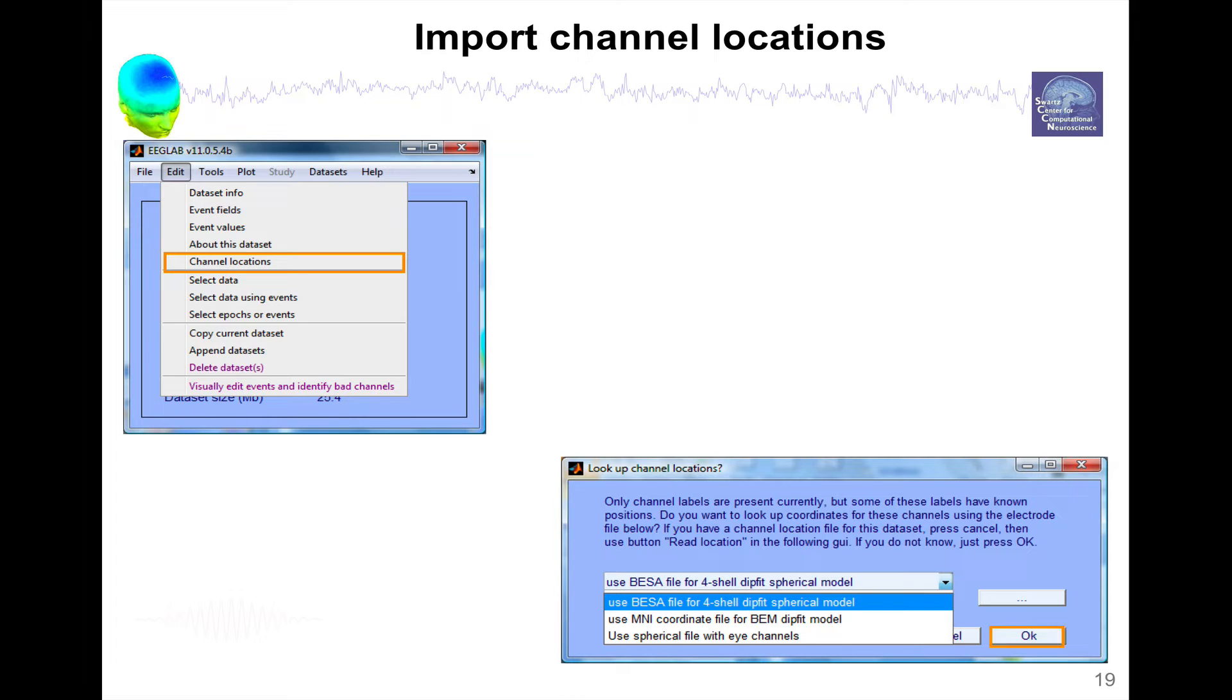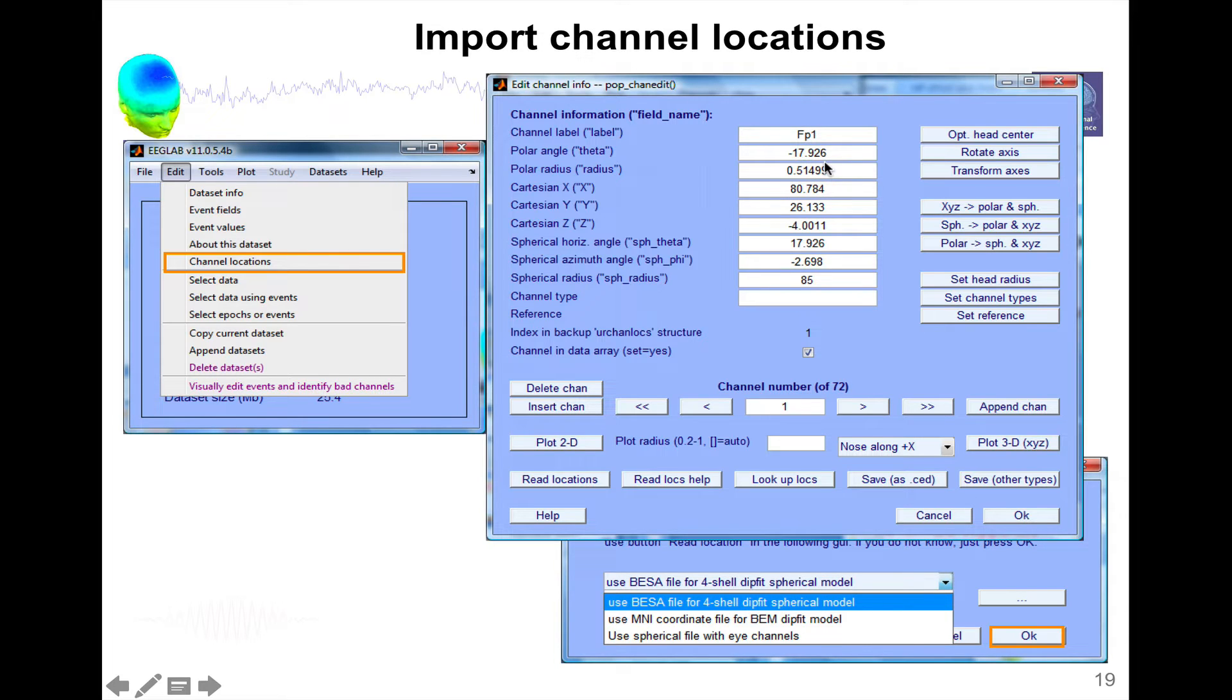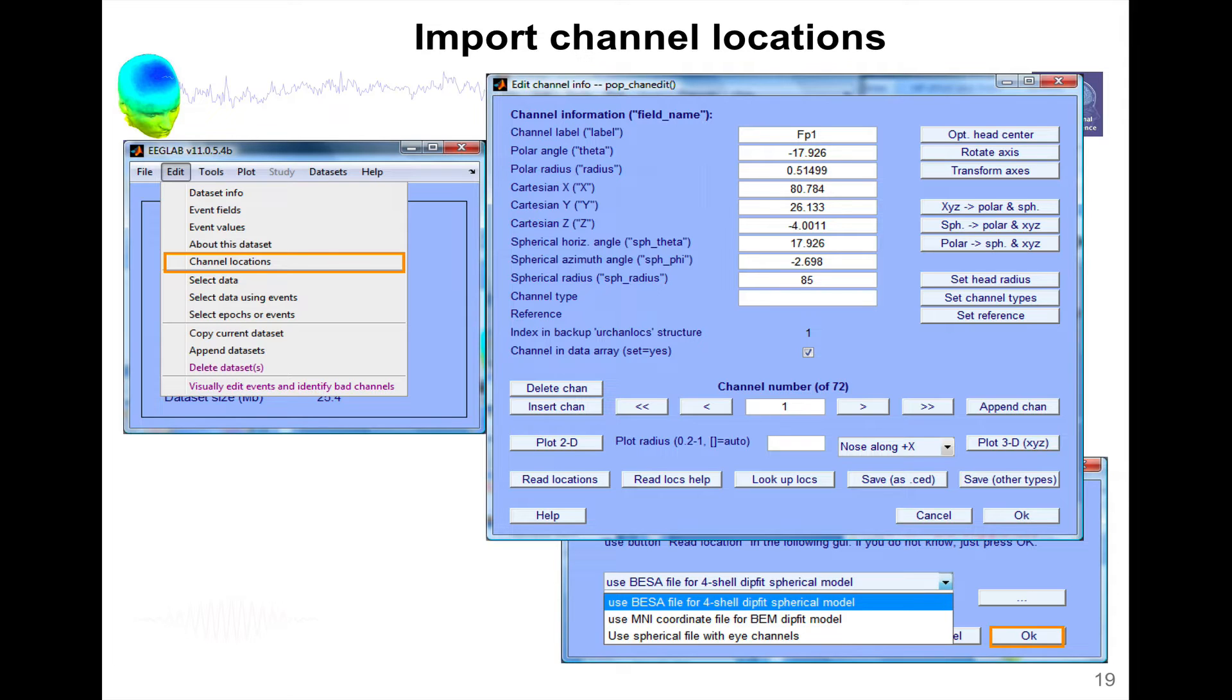If you press OK, it's going to pop up. Now we have the channel labels and we have the location of the channel. We have the location in three different coordinate systems. We have Polar Angle and Polar Radius, so that's Planner Polar Coordinates. We have Cartesian 3D Coordinates, XYZ. We have Spherical Coordinates. The reason we have all these coordinate systems is different types of channel location format use different coordinates, so we wanted to support them all.